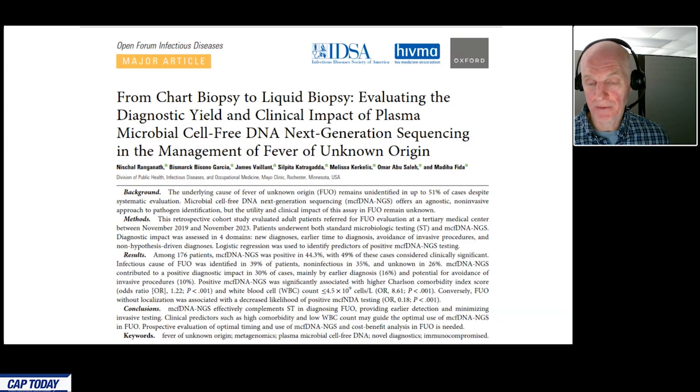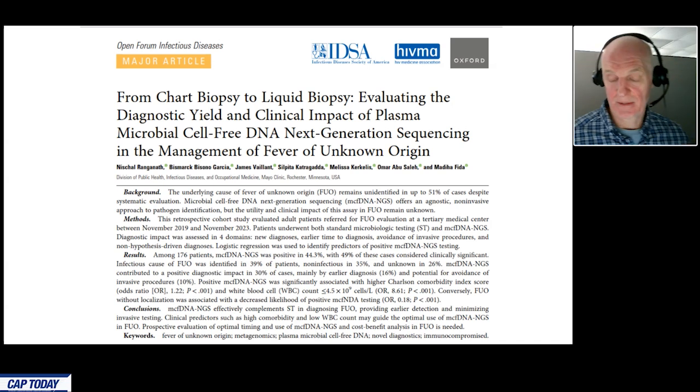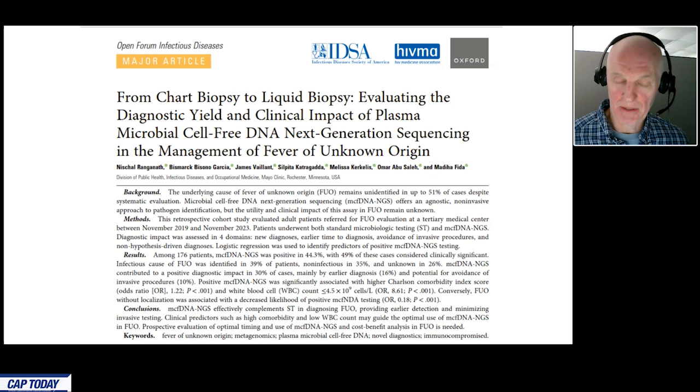So 2 months ago, in February of 2025, a group at Mayo published their experience with the Karius test specifically for patients with FUO over a 4-year period. This is a worthwhile read, in my opinion, and certainly available on PubMed. Although if you just Google chart biopsy to liquid biopsy, this paper will be your first hit.